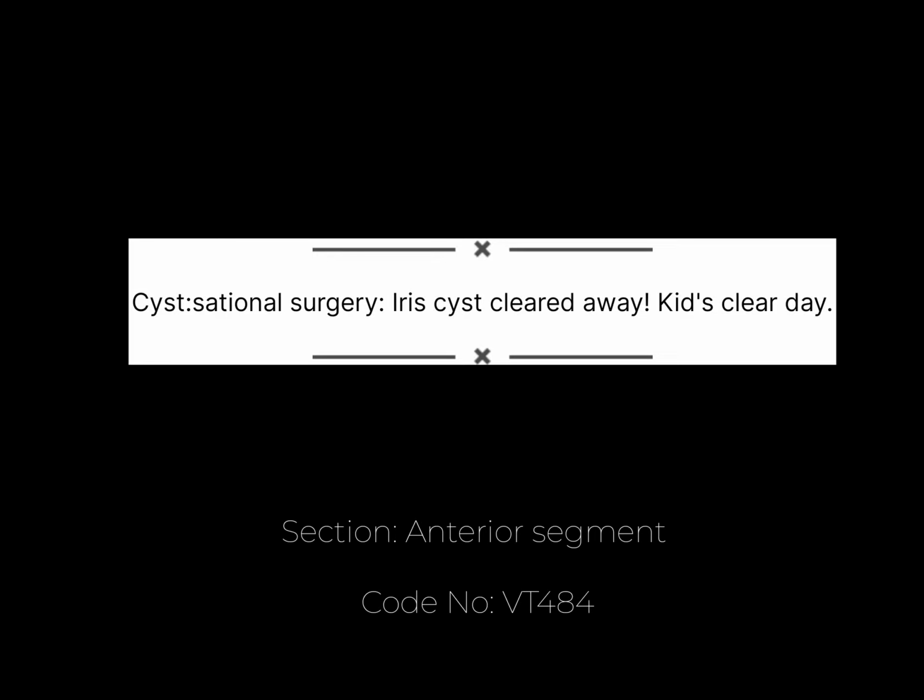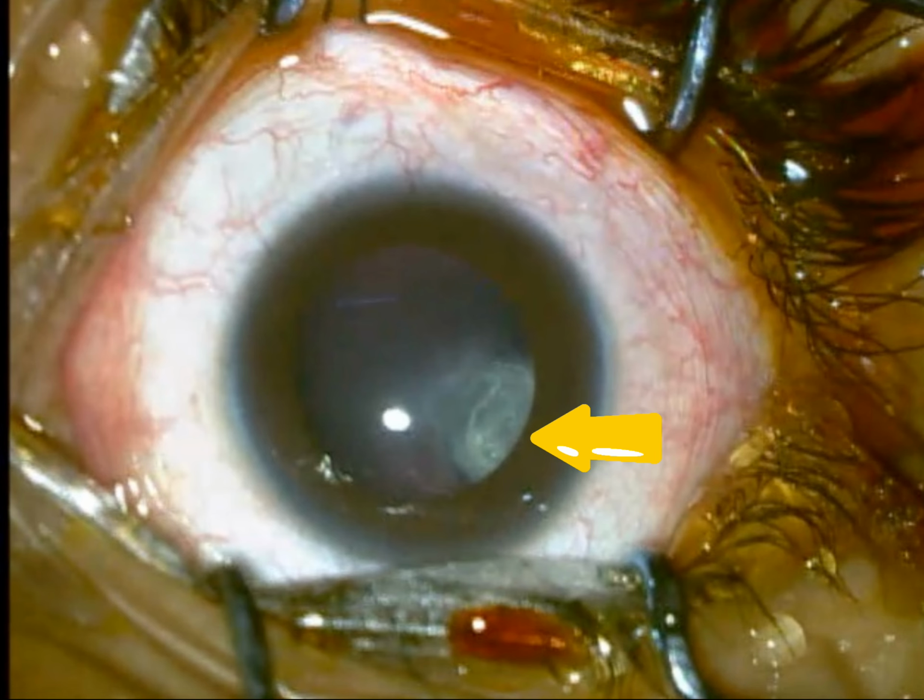Presenting to you a rare case of a benign epithelial cyst probably arising from the iris invading into the lens. A 10-year-old boy presented to us with complaints of diminished vision in left eye. On examination, his best corrected visual acuity was 1/60.